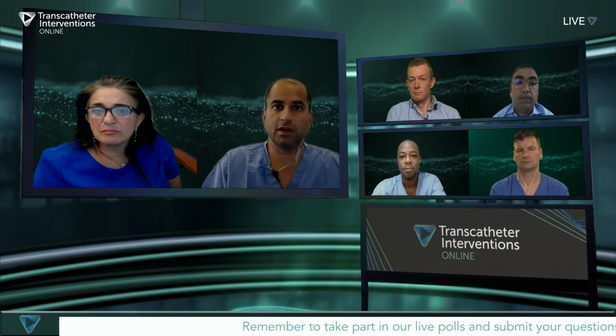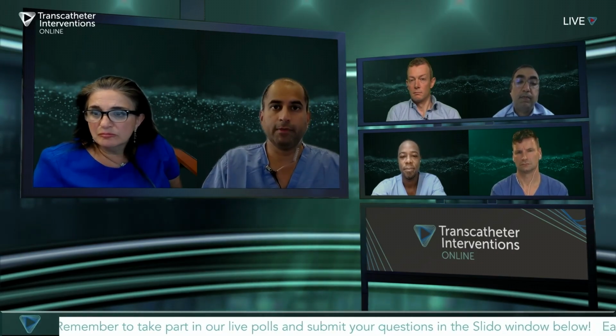We already are using the peripheral balloon off-label, with hesitancy, but we obviously have to use it in certain cases where the risks of other approaches, for instance, a stent under expansion, would be a challenge. Just remember, though, if you're going to use shockwave, old stents is different than new stents. It can actually cause structural damage to the stent itself for a new stent. So that's not the type of scenario where you want to put a new stent in and then use the device right after that. That's right. So really important point on shockwave.